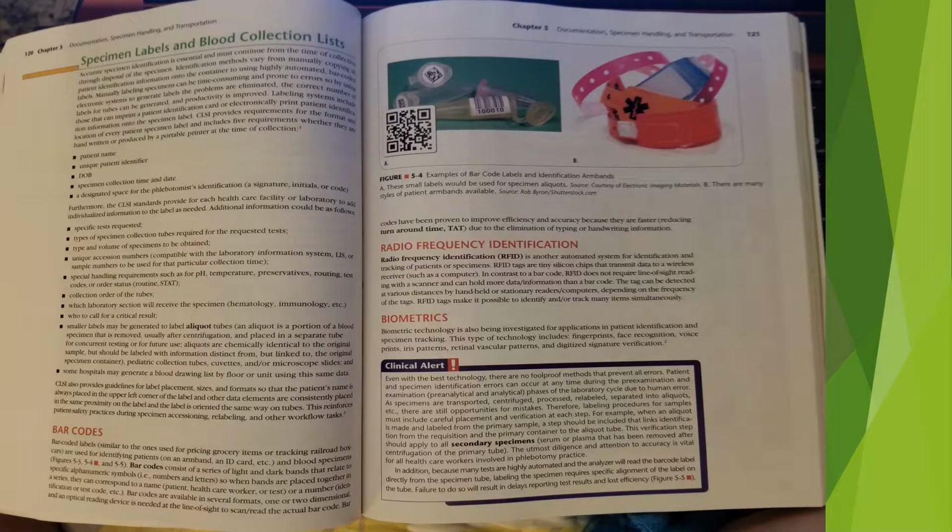Specimen labels and blood collection lists. Accurate specimen identification is essential and must continue from time of collection through disposal of the specimen. Identification methods vary from manually copying all of patient identification information onto the container to using highly automated barcoded labels. Manually labeling specimens can be time-consuming and prone to errors, so by using electronic systems to generate labels, the problems are eliminated. The correct number of labels for tubes can be generated and productivity is improved. Labeling systems include those that can imprint a patient identification card, or electronically print patient identification information onto the specimen label.